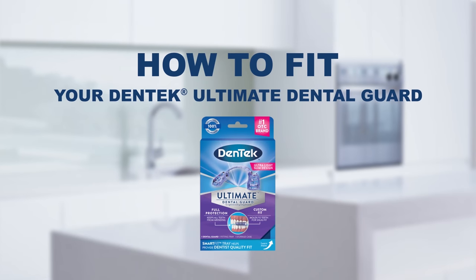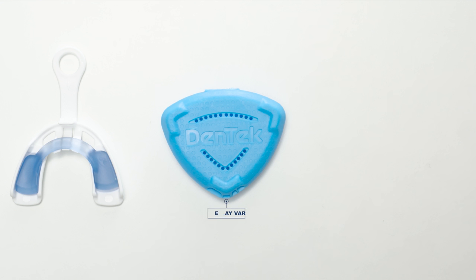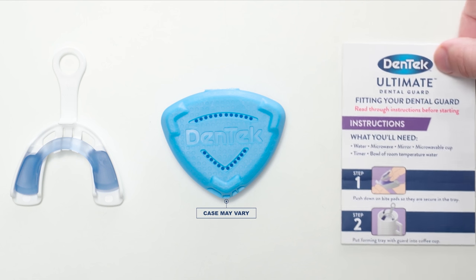How to fit your Dentec Ultimate Dental Guard. With this video, you'll see how easy it is to get an exceptional custom fit in just a few easy steps.